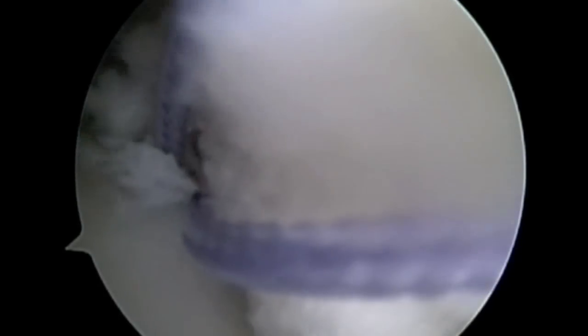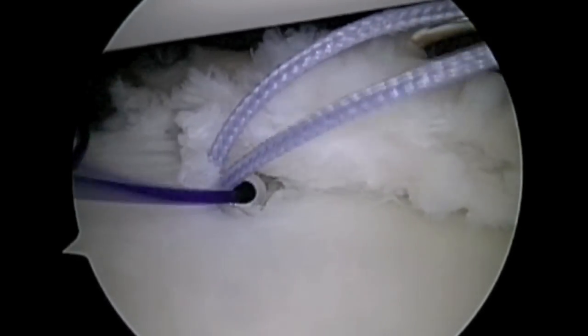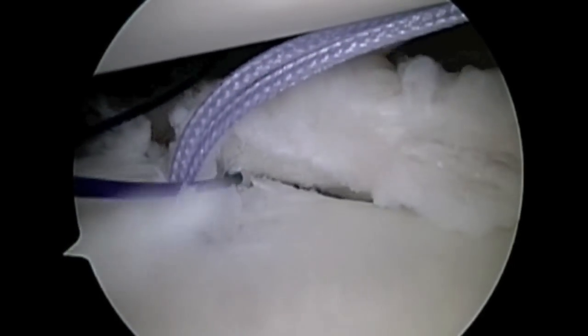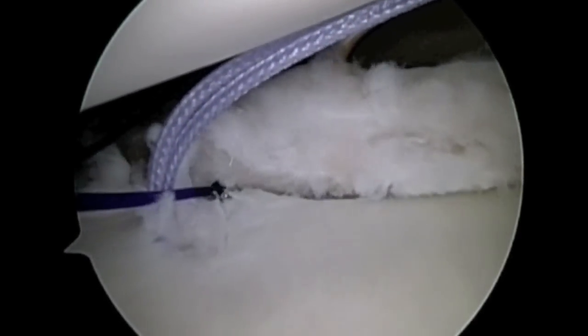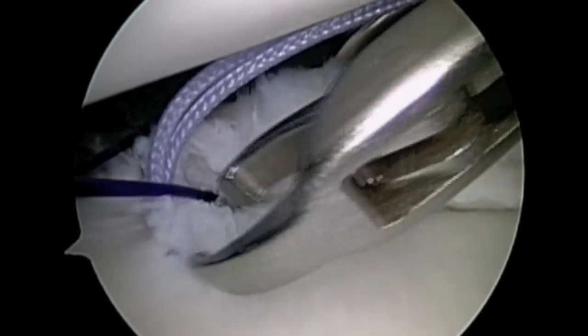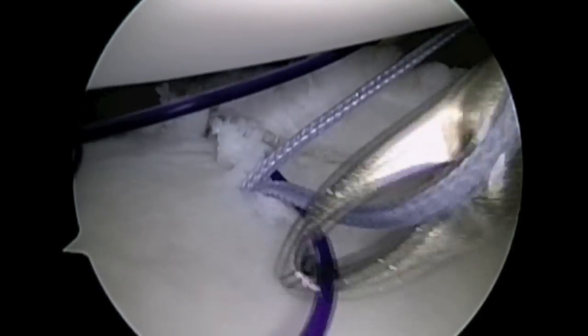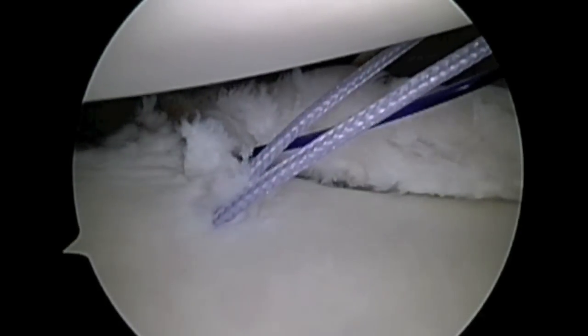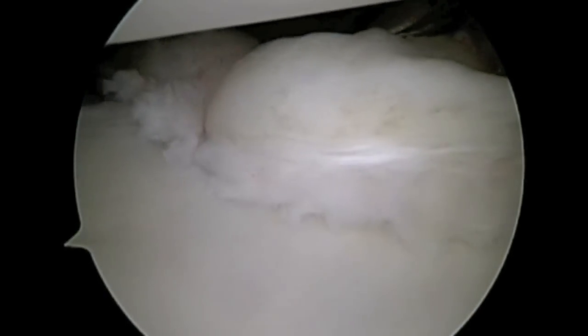A suture passing device is placed through the capsule to take a tuck of it and tighten it down, and also underneath the labrum. This passing suture will then be used to take one limb of the suture in the suture anchor below the labrum and through the capsule. The other limb of the suture will go above the labrum and the capsule, and the suture is tied down to repair the labrum and the capsule against the glenoid.